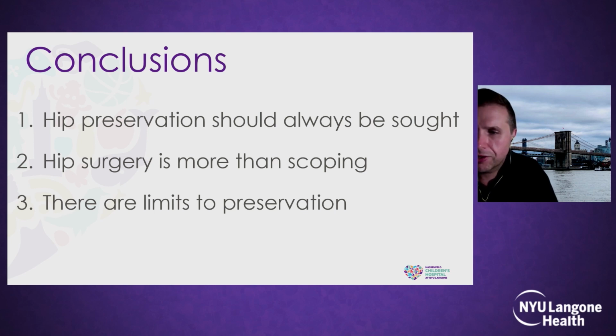So thanks very much. And 5% said arthroscopic osteochondroplasty for that. Amazing. It wasn't me. Pablo, thank you so much. I mean, those cases looked amazing. And it just goes to show, as serious as we are about arthroscopy, open surgery still looks pretty cool.